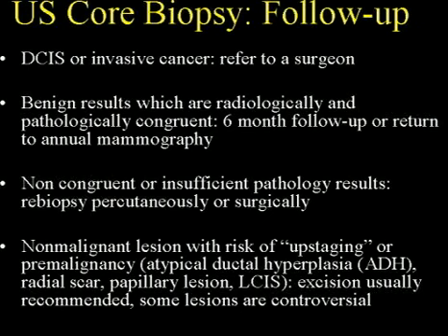Non-congruent or insufficient pathology results. In this case, a re-biopsy is needed either percutaneously or surgically. And then the other issue is non-malignant lesions with risk of upstaging or pre-malignancy. This can be a whole other lecture unto itself. Dr. Mercado talked about papillary lesions. Many of these lesions, excision is recommended, but many of these lesions are also controversial.